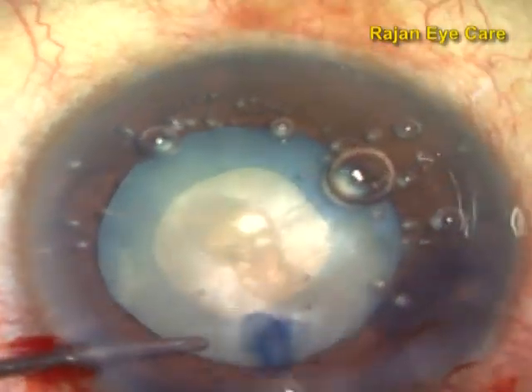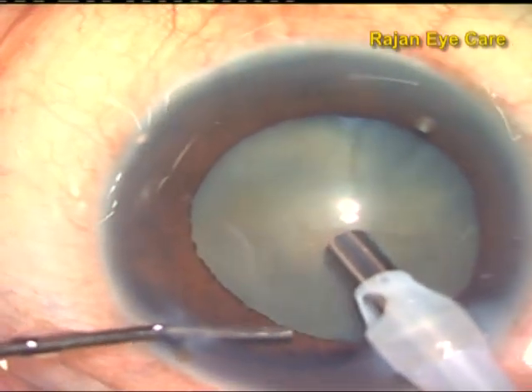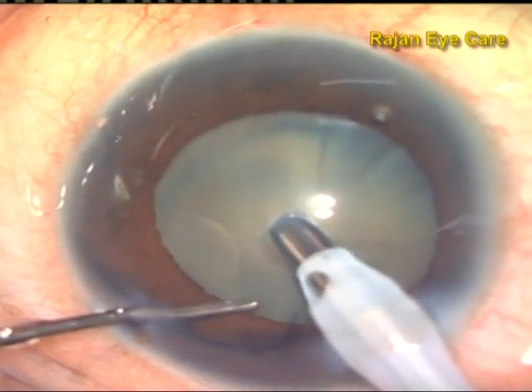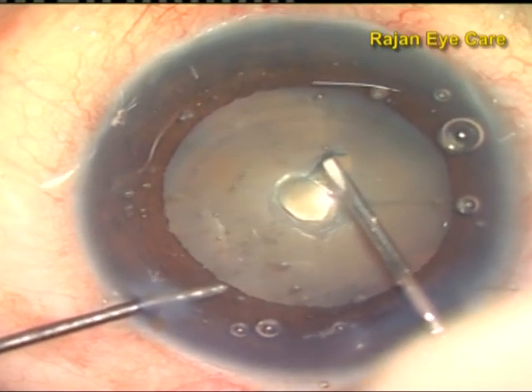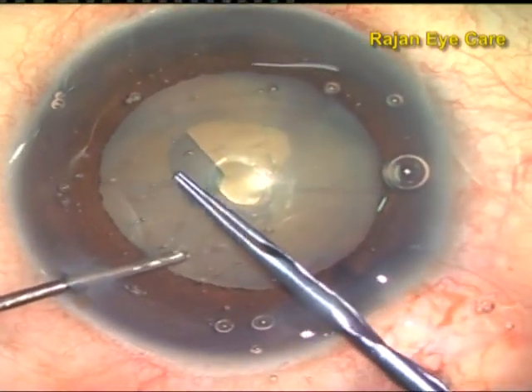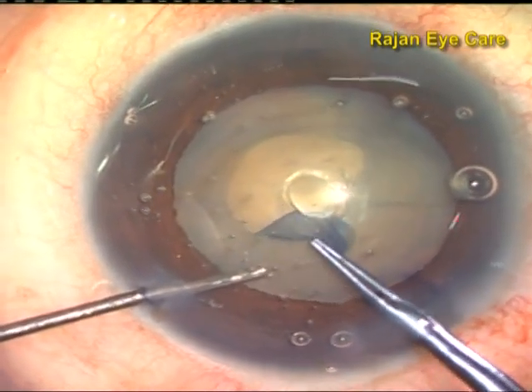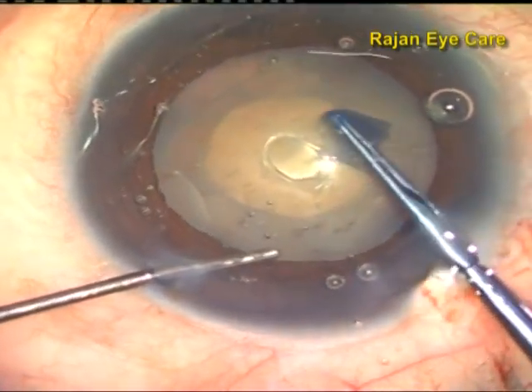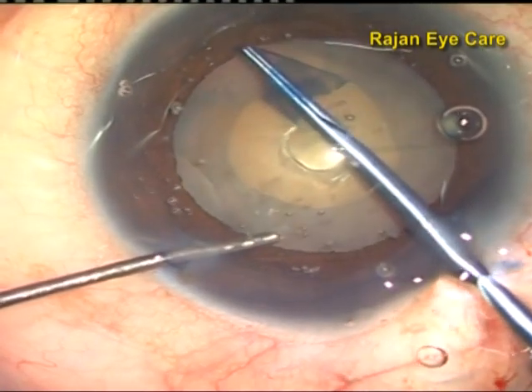After the punch, I use regular viscoelastic like HPMC, and then complete the rhexis with the Utrata forceps. In the panchorexis, again I am going bevel down, and in one stroke I am doing a punch of the anterior capsule, while simultaneously giving a burst of phaco emulsification. Thereby there is slight debulking of the center of the nucleus, and because of this debulking and the sudden decompression of the intralenticular pressure, there is no time for the capsule to extend to the periphery, thereby preventing an Argentina flag sign.